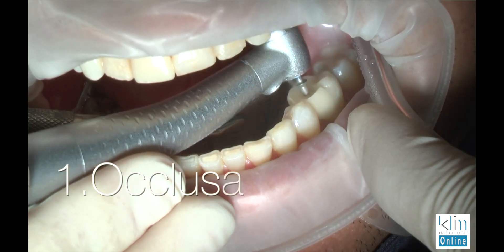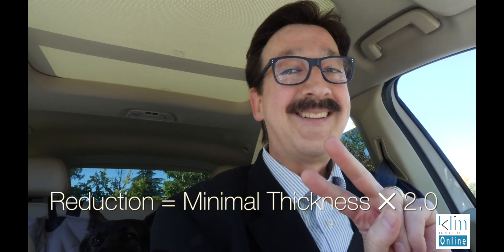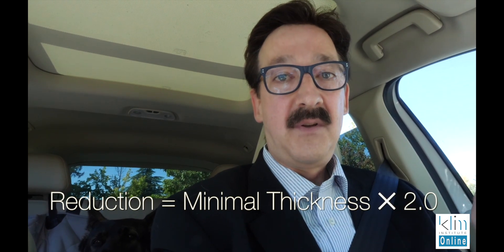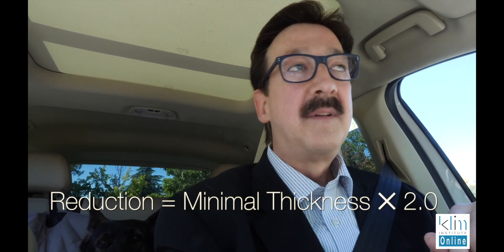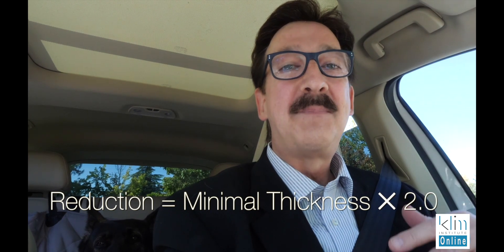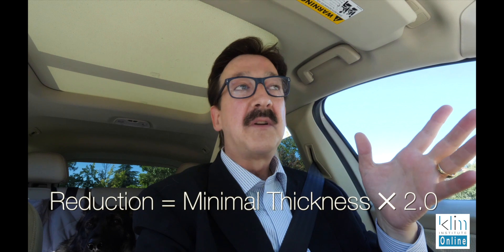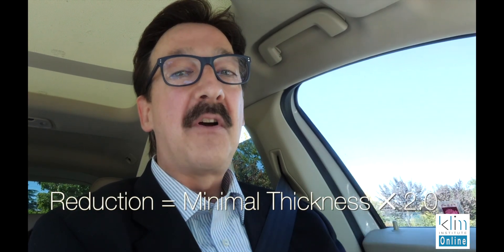Most people struggle because they don't reduce enough. I've been a clinician over 30 years and I know I struggle with reduction, but you've got to be precise. If there's one area I'm not conservative on, it's occlusal reduction, because it's more than minimal thickness. If you do minimal thickness reduction, you're going to struggle with the software because you'll get flat crowns — and the software doesn't like flat crowns, it likes to give you good morphology. It's the DNA of the software. You've got to know your materials: high-strength zirconia 0.6mm, Emax 1mm, Seltra 1.5mm, Empress 1.5mm, microfeldspathic 1.5mm. Every situation in the mouth is different. When you know the limitations with function and form, you can use critical thinking to prep for the right material — and that's how you start a really good workflow.